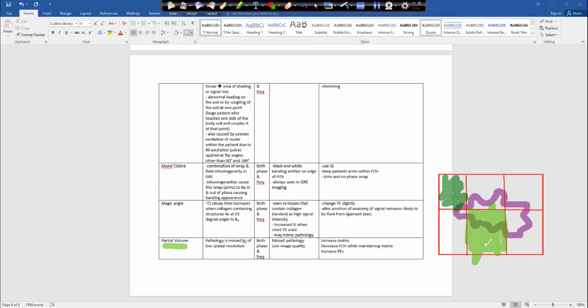And maybe on the first year, nothing showed up because it was so small, because our slice thickness was 5 millimeters, it was averaged into those slices. But then a year later it grew, and now our 5 millimeter slices can detect it.